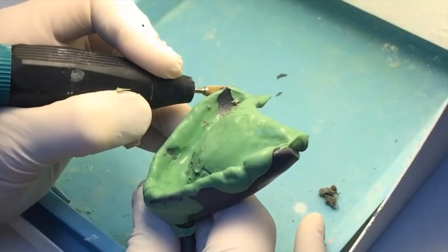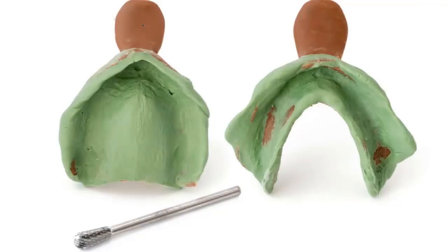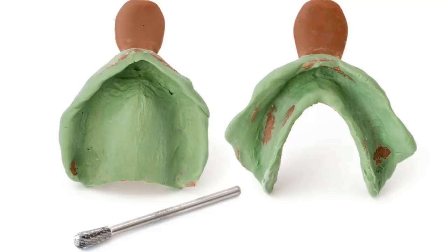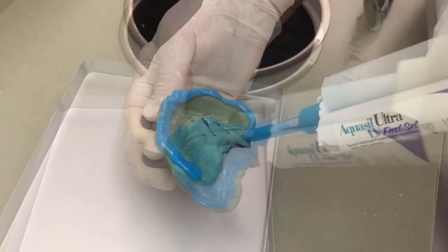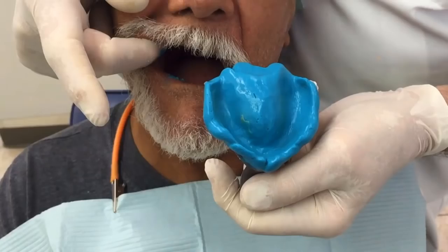Here's an example: on the maxillary tray you can see overextension in the tuberosity on the right and a show-through on the left. On the mandibular tray, there's overextension in the anterior labial area, the mid-alveolar ridge, and the masseteric notch. Just take that carbide burr and grind those spots liberally. Then take Aquasil Ultra LV Fast Set — light viscosity — place it into the tray, and make the final impression the same way: a light coating over the tray, cover the middle, place it in the mouth, border mold, and remove after two and a half minutes.